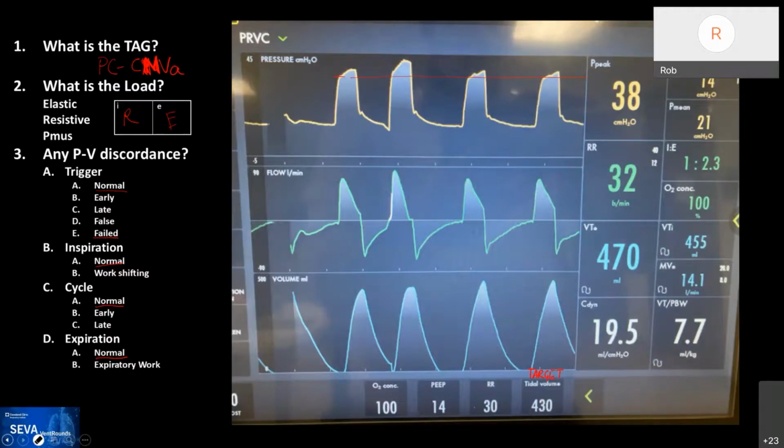Absolutely. Thank you for bringing that up, Rob. And that's a key of knowing what your ventilator actually does. And sometimes it doesn't come in the manual as clear as you would want it to. Rob, do we know if our Servo U targets the inspiratory volume or the expiratory, the previous? Expiratory. Sorry, you said expiratory? I believe that's true, yes.